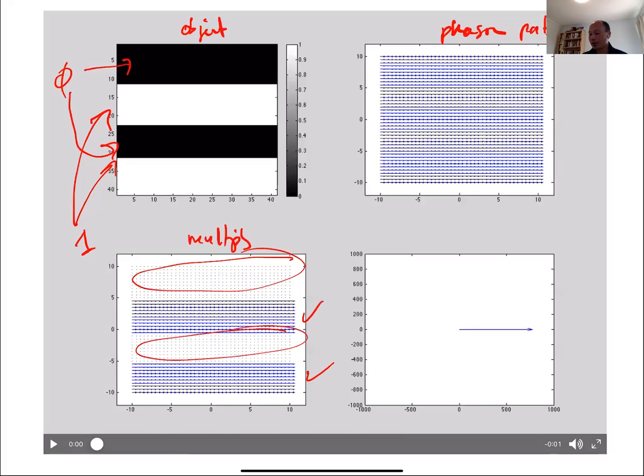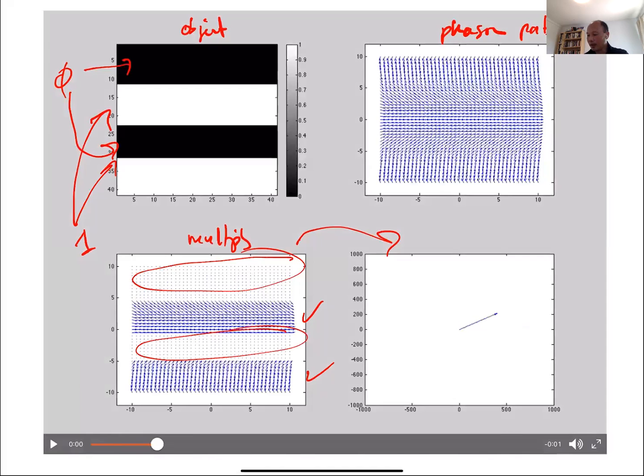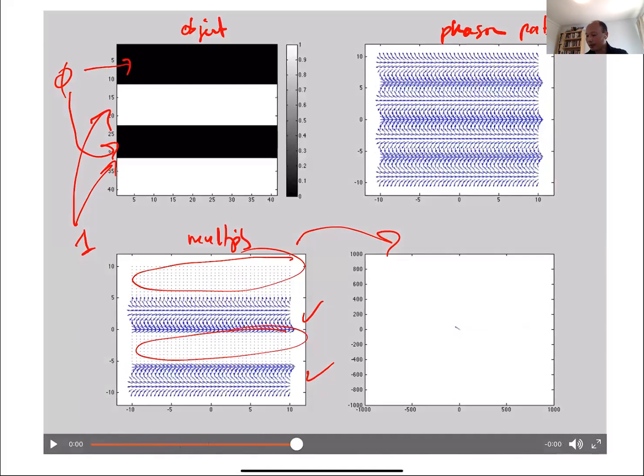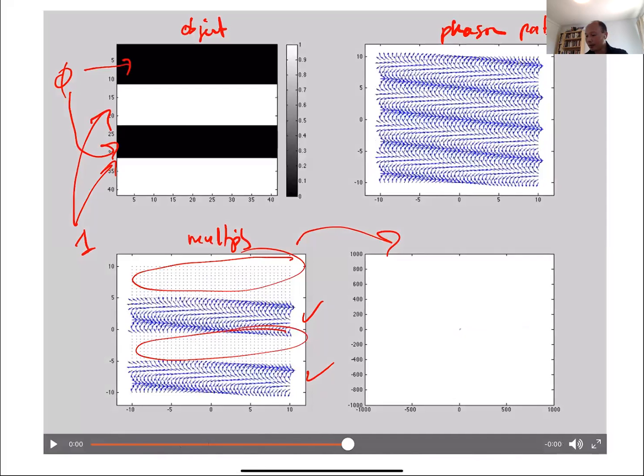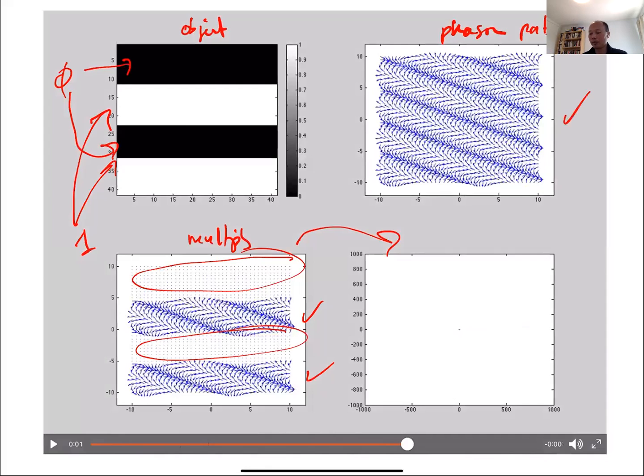And here, this is the sum of all those spins. We're going to start off at the center of k-space, and you see there's a pretty big sum. Notice as I move along k-space, I'm changing that spatial pattern. Here I have a diagonal spatial pattern, and I get a very small sum because that spatial pattern of diagonals doesn't really match my object very well.